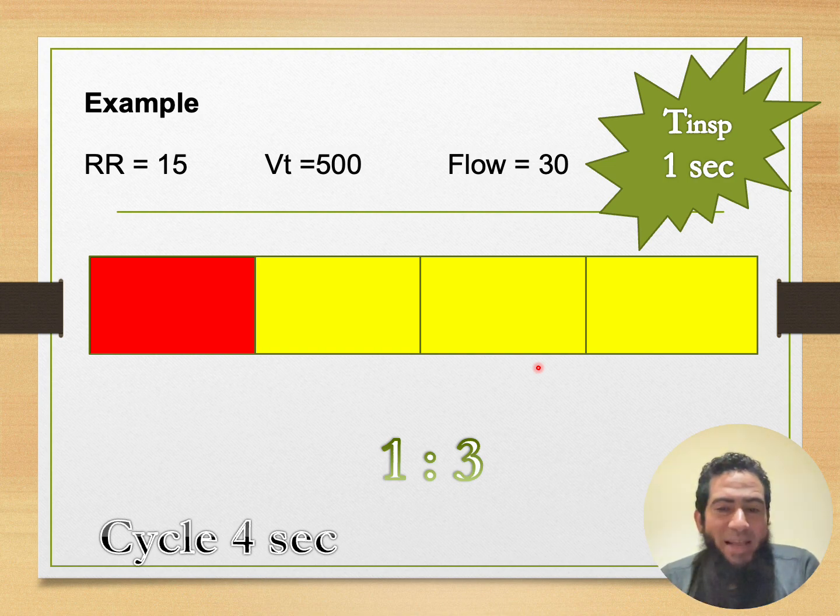So what's actually the benefit of this plateau time or post plateau? We will explain why we're calling it plateau and what's the benefit of this in the next slide.